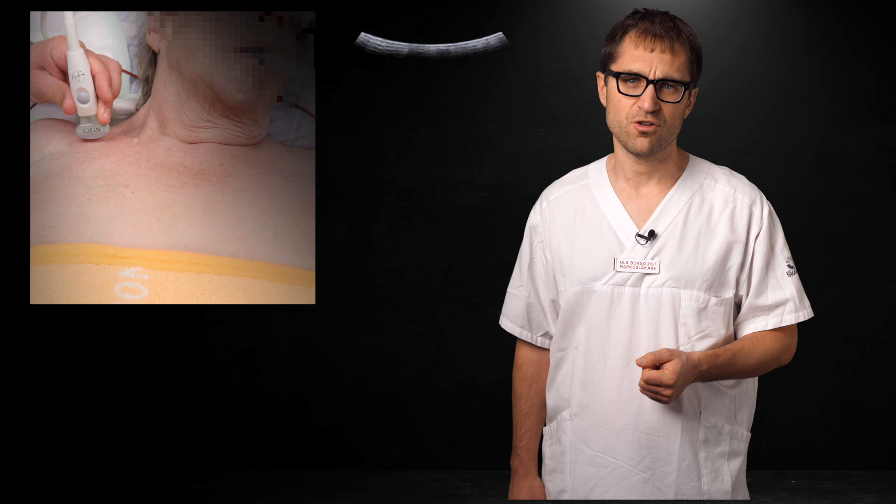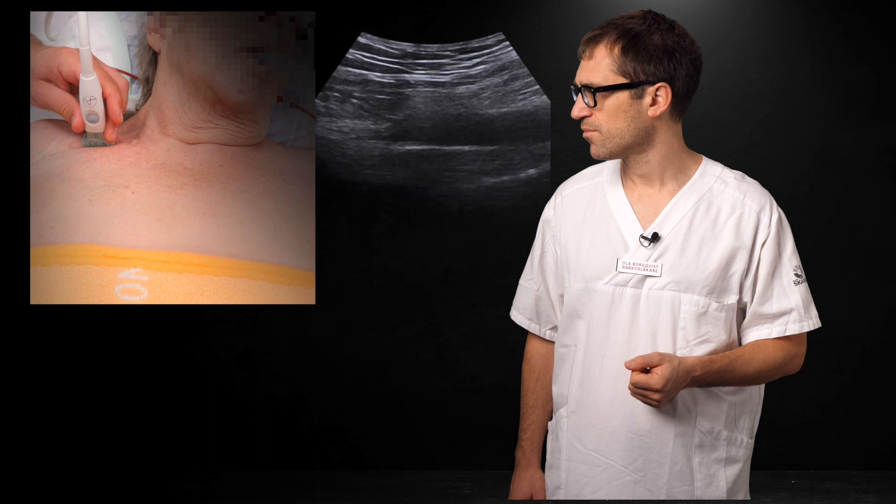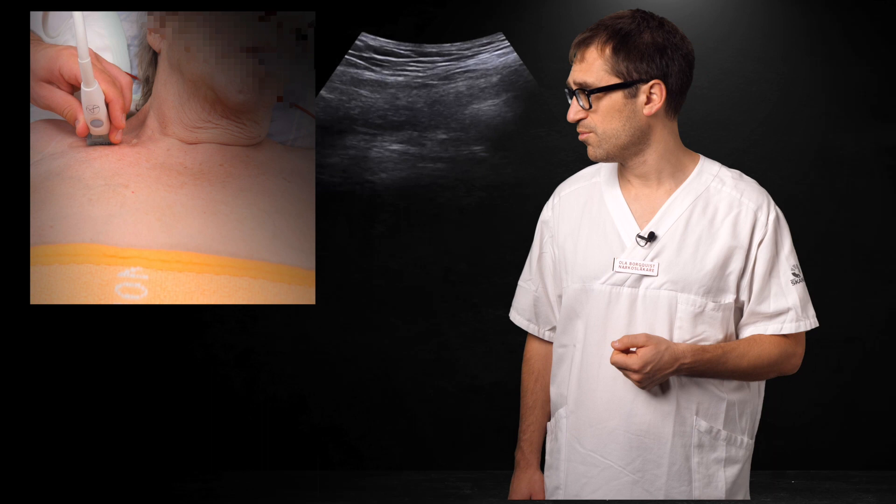Sometimes you just can't find the vein. It may be completely collapsed as it's a low pressure system. If you see only one vessel, as in this patient, always presume it's the artery.